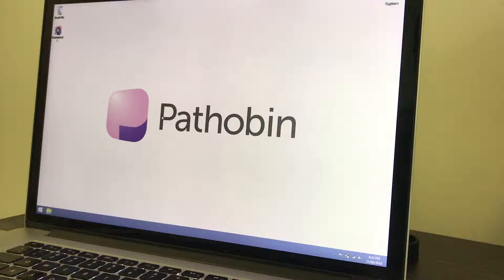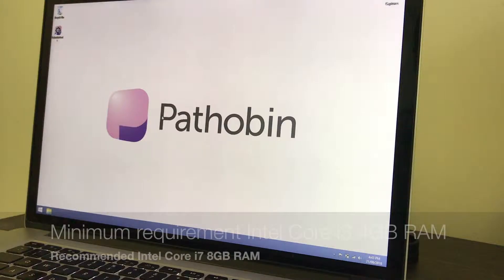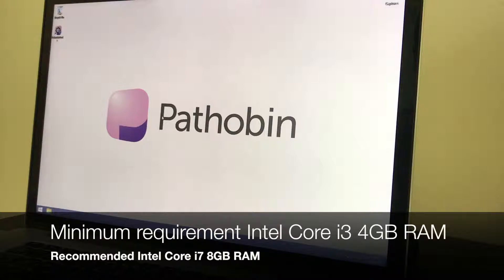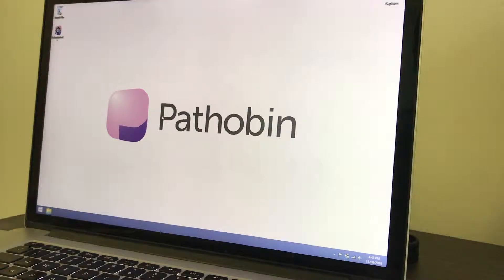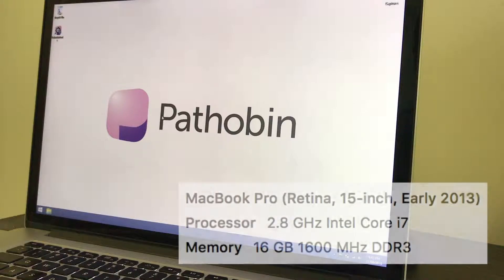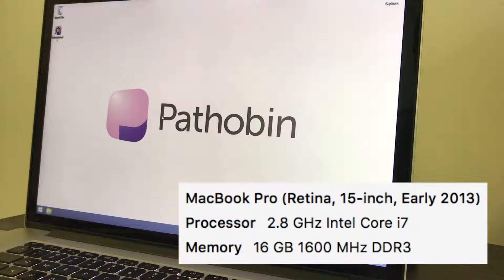Pathobin Tools is a Windows PC application, and for robust real-time stitching we recommend an Intel Core i7 or equivalent PC with at least 8GB of RAM. It may certainly still work with a lower-spec PC, but your mileage will vary. This demonstration is using a MacBook Pro with Windows 8.1 installed.